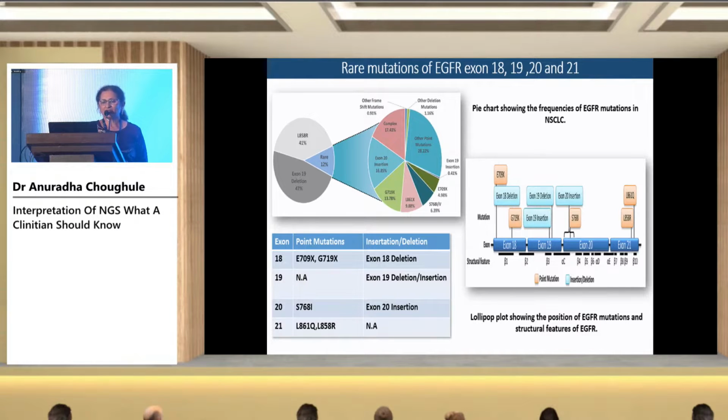And not only that, you also get to see the point mutations of S768I and exon 20 insertions, which we had missed when doing real-time PCR. A lot of importance has been created for exon 20 insertions, because you are seeing a lot of targeted therapy coming up.